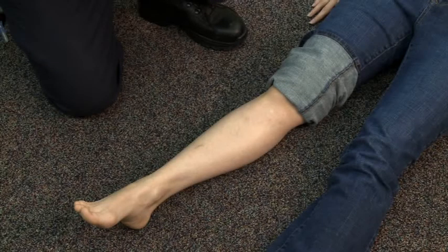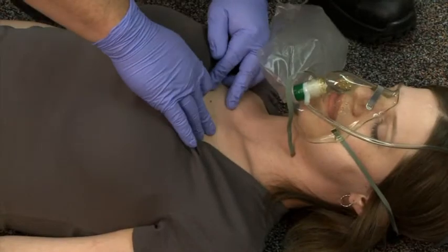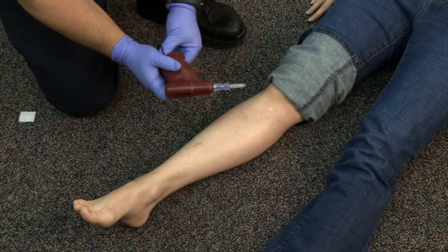This video will demonstrate establishing an intraosseous infusion site in a patient when traditional intravenous access is not possible. This technique may be performed in both adult and pediatric patients using a variety of commercially available devices, including manual and battery-powered devices. The choice of insertion site may be the anterior tibia in children or adults, or the sternum, used only in adults. This video will demonstrate establishing an intraosseous infusion site utilizing the anterior tibia and a battery-powered insertion device.